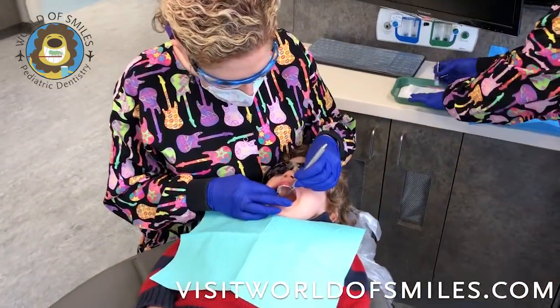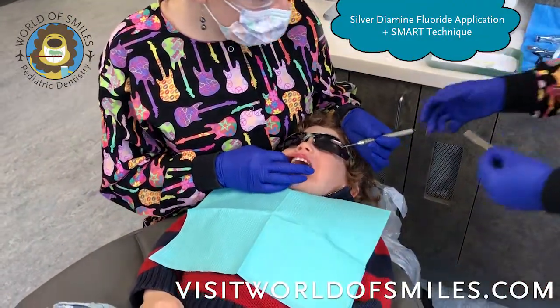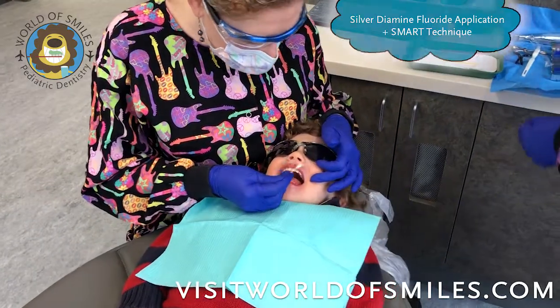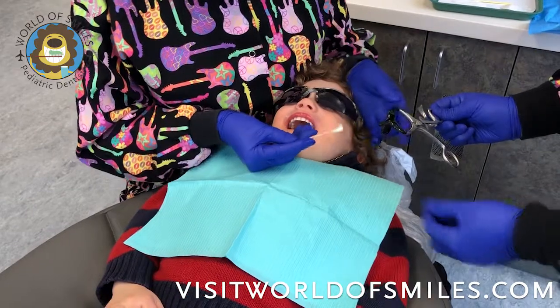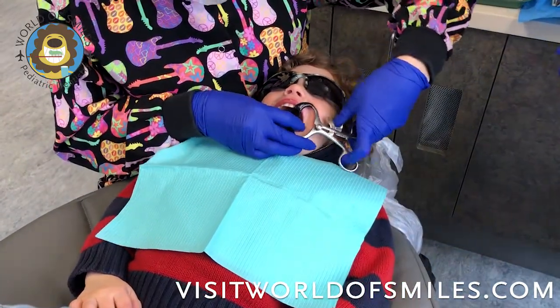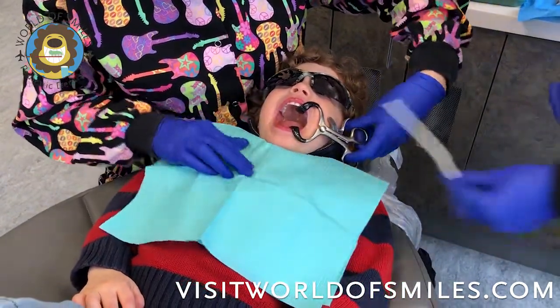This is Dr. Michelle Stafford at World of Smiles Pediatric Dentistry, and today we will be talking about silver diamine fluoride application along with the SMART technique — silver modified atraumatic restorative technique.